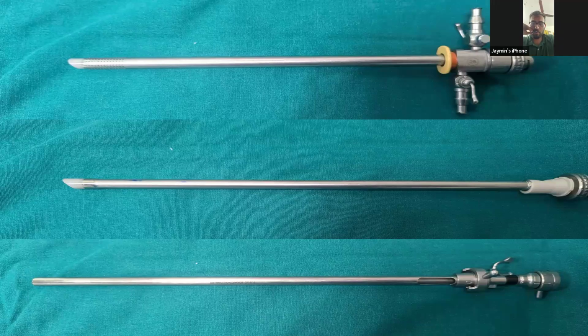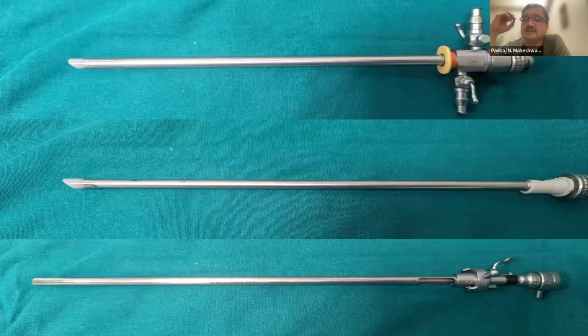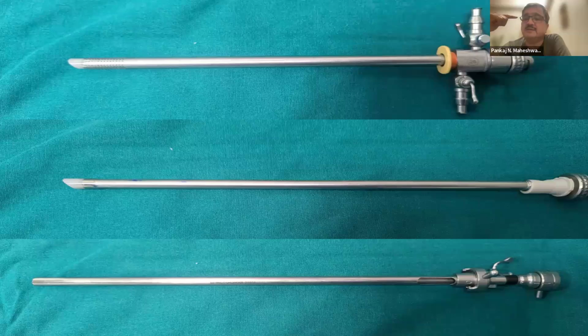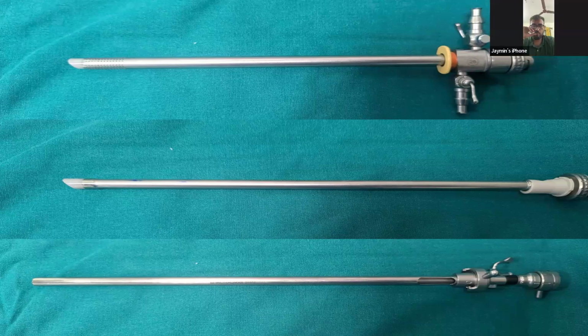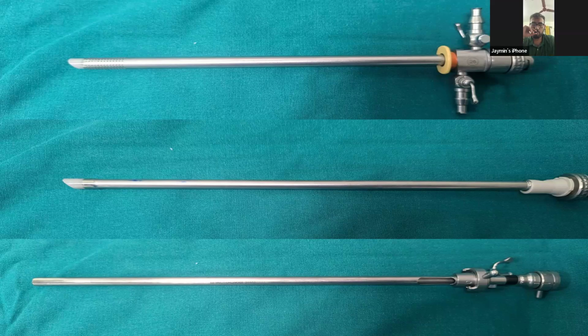Why was it devised? Why was the Iglesias system devised? It was devised so that the irrigation remains low pressure irrigation. If it's a high pressure irrigation, the fluid intravasation will be very high. This continuous irrigation makes it into a low pressure system, so fluid intravasation will reduce. Yes, sir.